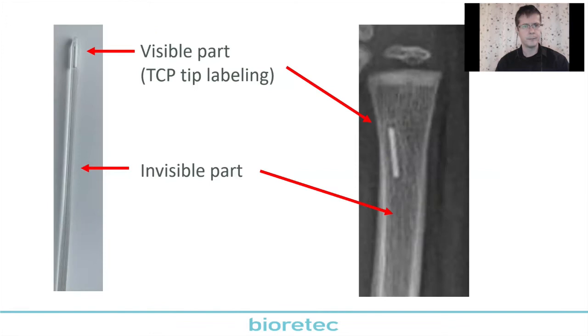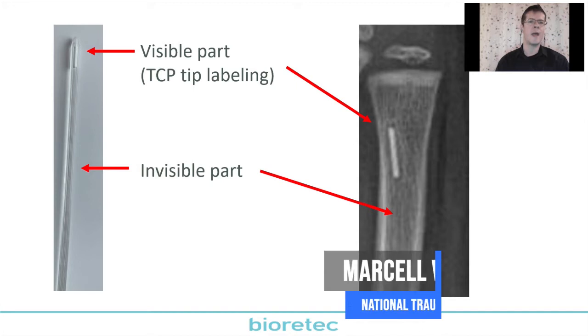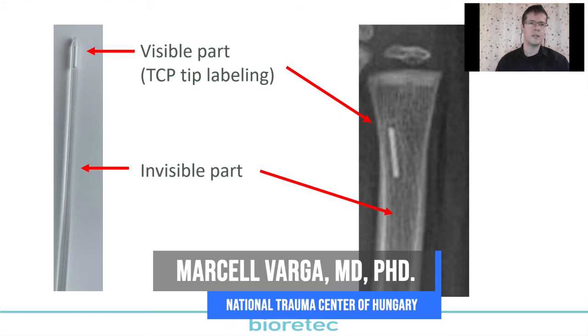It can be very frustrating for a trauma surgeon during the operation that we don't see the whole implant. We see only a small part of the implant. This is the TCP labeling, and as we can see here, only this small part is visible on the fluoroscopy. But this small part shows us where the nail is at the moment. So we have to be accustomed to this picture, because we won't see the whole implant, because the PLGA material is invisible to fluoroscopy.